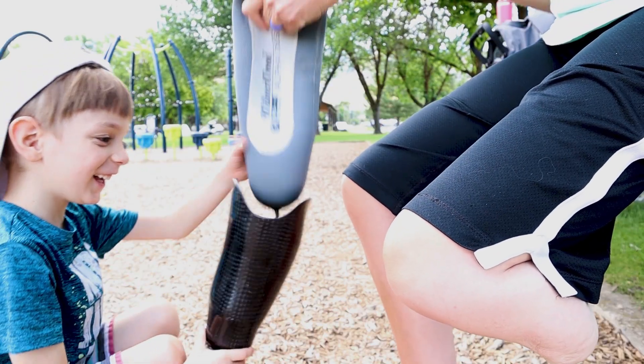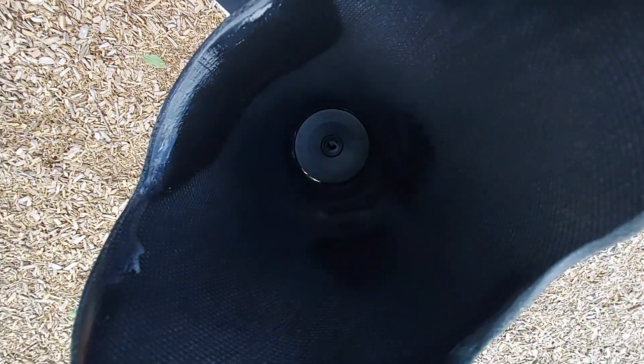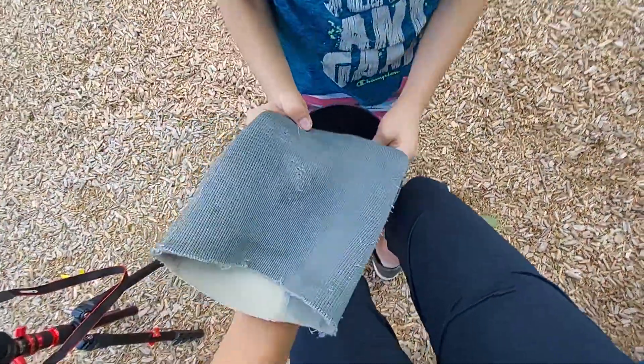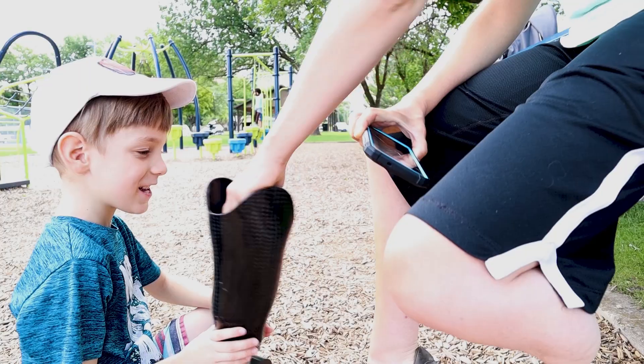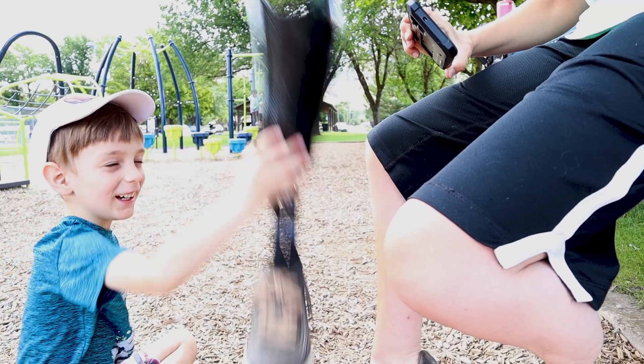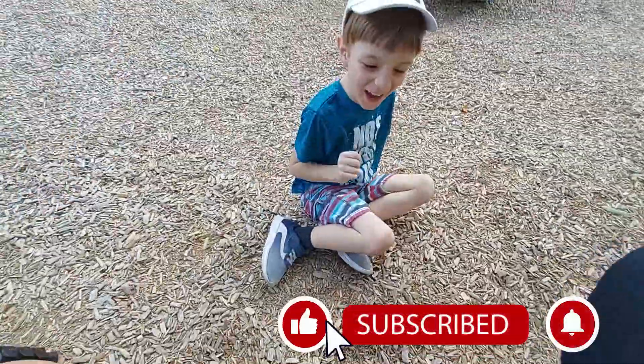Then that pin on the end fits in that hole inside my socket leg. The cup-like part is called a socket. See these ridges on the pin? They click into place, which holds the liner onto the rest of the prosthesis. And when I'm ready to take off my leg, I just push that little button and off it goes.